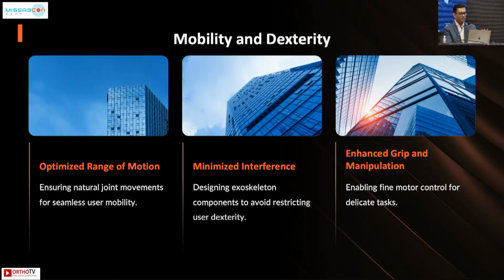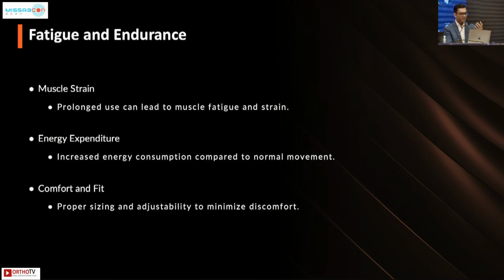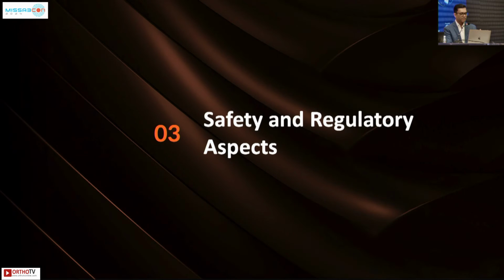The battery shouldn't be too excessive. The design should be very conducive. There should be a proper grip. If you have a hand grip, then you need a proper grip and proper manipulation. And fatigue, muscle fatigue, energy expenditure through the battery, and the comfort of wearing are the biggest challenges in designing.